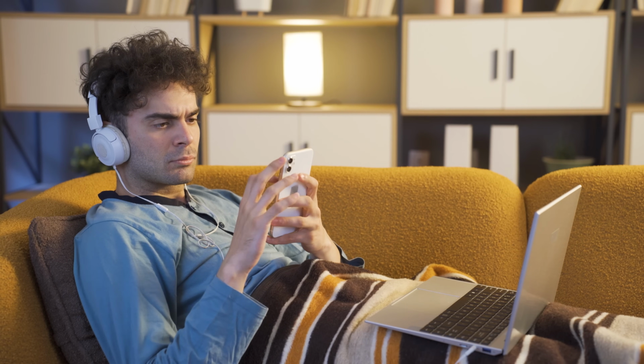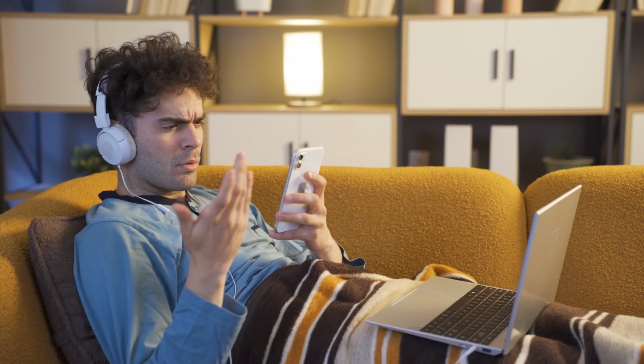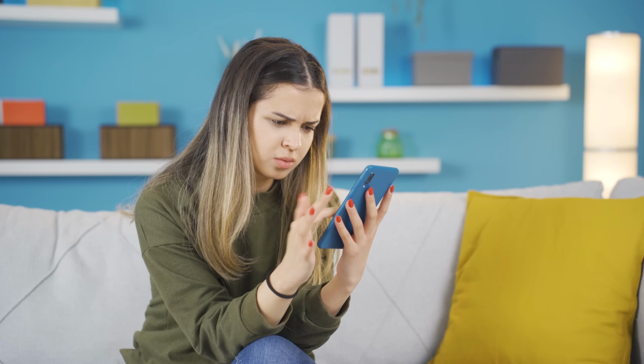Just as we see with computers, smartphones are really controlling many different things at once. The overlap between these different functions can cause some wires to get crossed up in the phone, ultimately causing some glitches with the connectivity with your hearing aids. Using just 2 minutes to restart your phone once a week helps to close out of any apps that might be running in the background and remedy any glitches in the code that may have occurred over a week's worth of use.